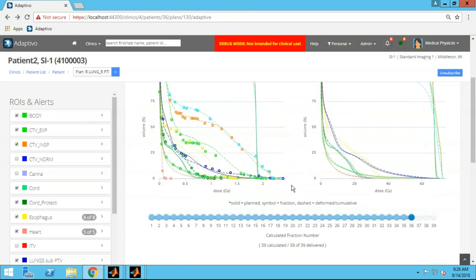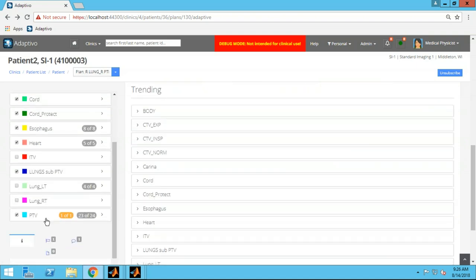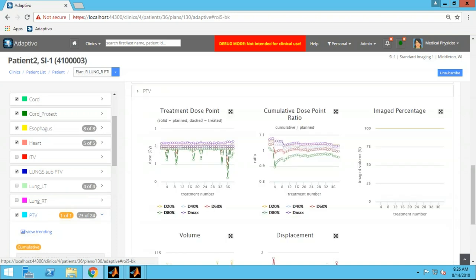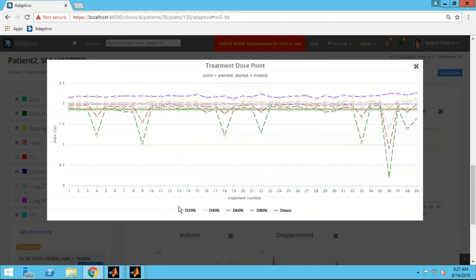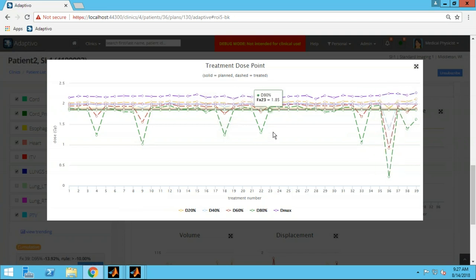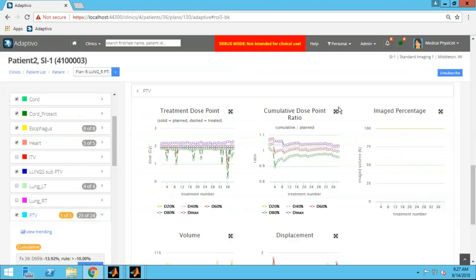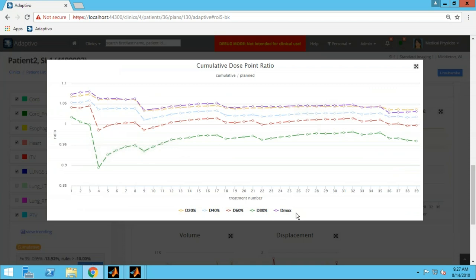I can step back to any prior delivered fraction to see what the DVH looked like on that day. On fraction 33 we had a pretty nasty under-coverage of the target, and on fraction 36 this was even worse. Scrolling to the trending information, the treatment dose point trend shows snapshots of the daily DVHs — points off the daily DVH at each fraction. You can see that under-coverage on fractions 33 and 36, and also on a couple of prior fractions. The cumulative dose point ratio plot shows the same for the cumulative DVH — the ratio of cumulative to plan, where ideally everything would be at one across the board — and you can see how those under-coverage days shifted the cumulative DVH.